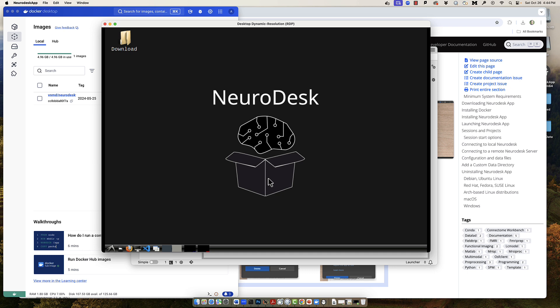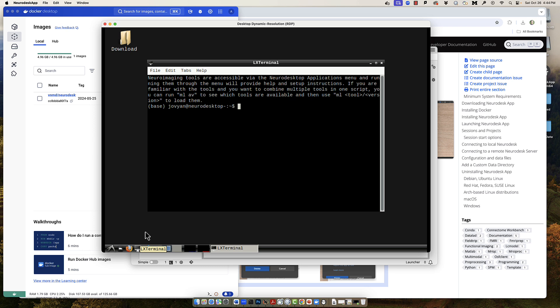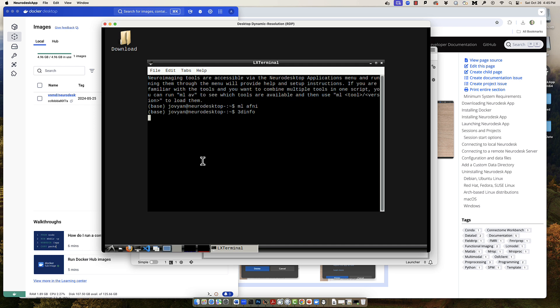To test whether the libraries work, open a terminal by clicking the icon in the bottom tray of the new window. Then in the terminal, type 'ml' for module load, then 'afni', and then type something like '3dinfo' — one of the most common commands in the AFNI library. You should see the help file for it by default, indicating that the libraries are loaded and you can use these commands.